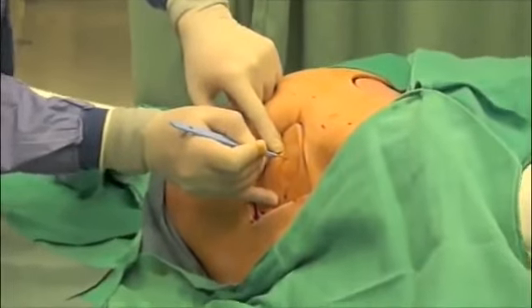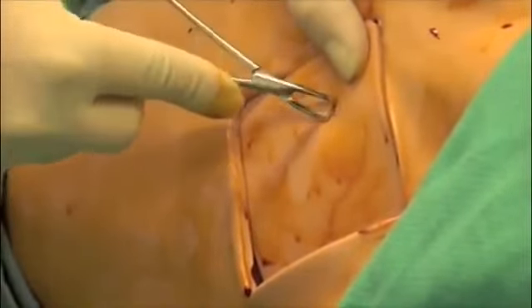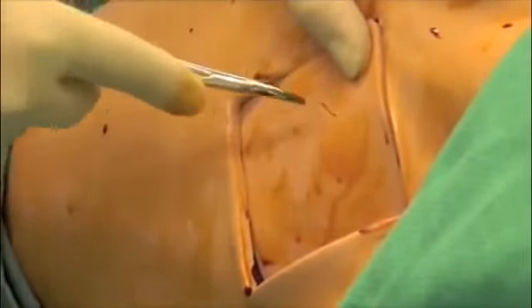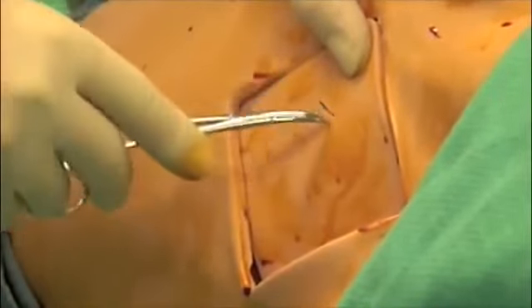Using a scalpel, make a 2 to 4 centimeter incision following the orientation of the ribs. Using curved forceps, bluntly dissect through the subcutaneous tissue just over the superior border of the rib.